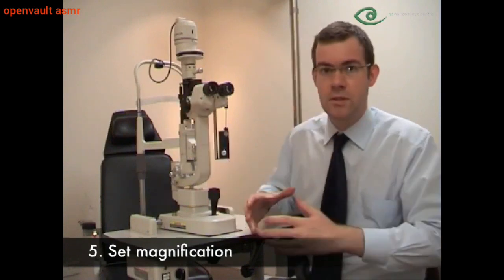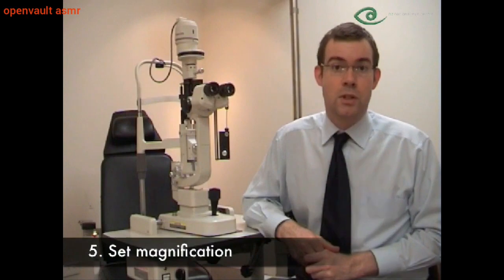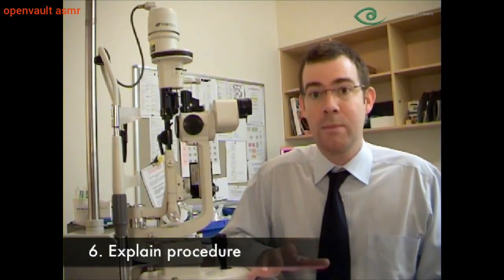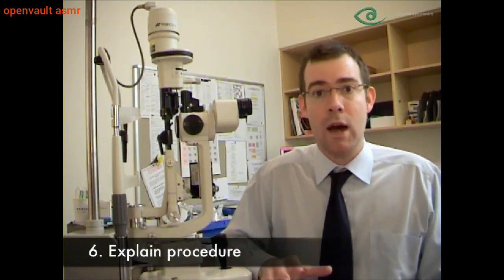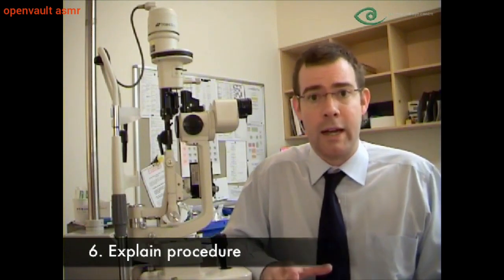The slit lamp is now ready to use, and you may want to do those steps before the patient comes into the room. The next step is to explain the procedure to the patient. You want to tell them that you're going to use a microscope to examine their eye, and that they'll see a very bright light, but that this light won't damage their eye.